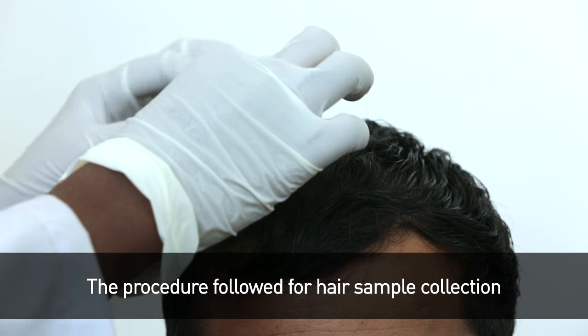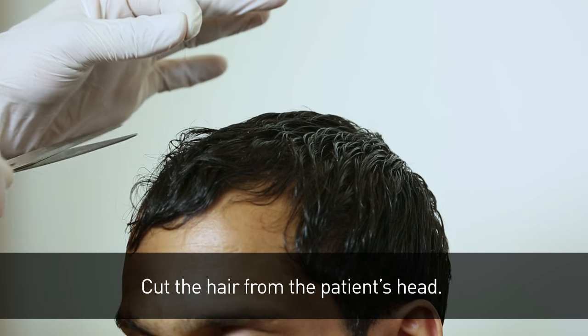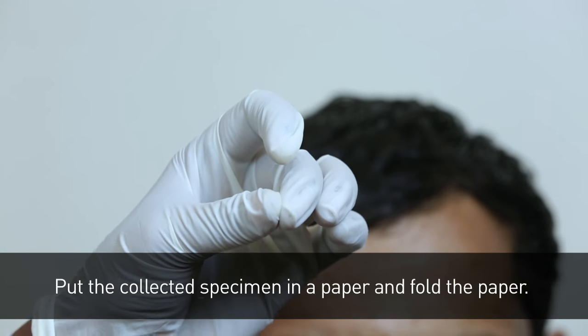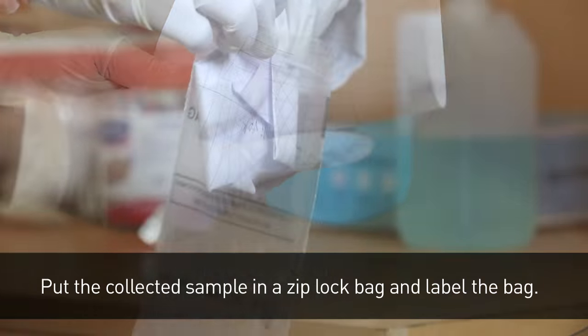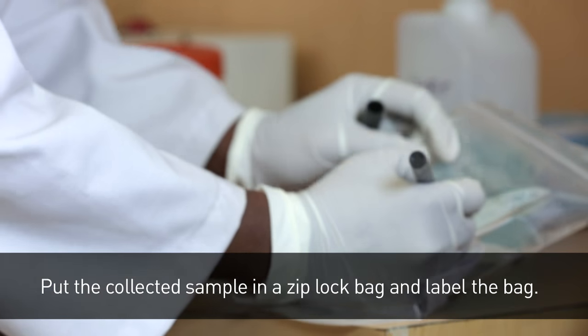The procedure followed for hair sample collection. Cut the hair from the patient's head and scrape the scalp to collect the specimen. Put the collected specimen in a paper and fold the paper. Put the collected sample in a ziplock bag and label the bag.